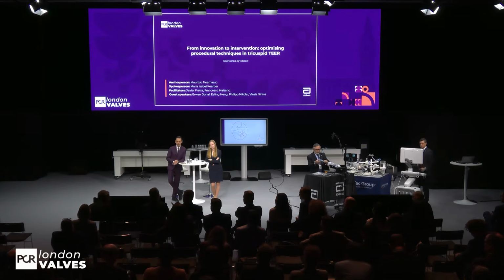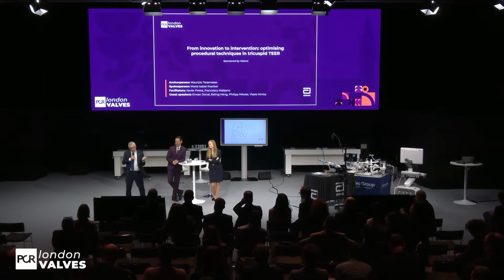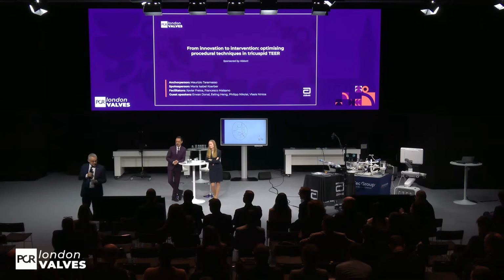So then, sometimes, an option for those patients is jailing. Try just to keep a clip on each side of the lead and see what happens. But they are definitely difficult cases. I love this jailing concept. How often have we done these cases? Many now. How often do you jail and are effective in jailing? Almost never. No, come on, let's be honest. How often at the end, when you jail, in most occasions it goes where it wants. We need also to be practical, guys.